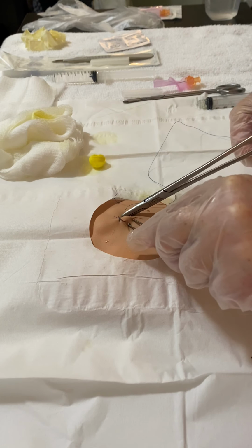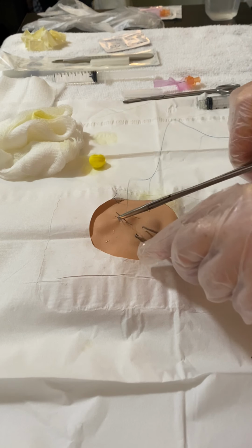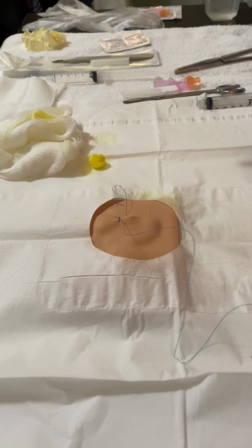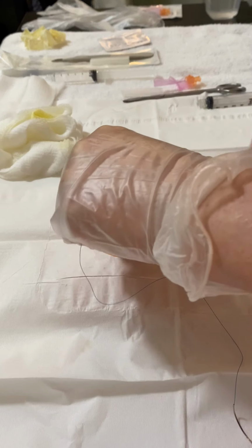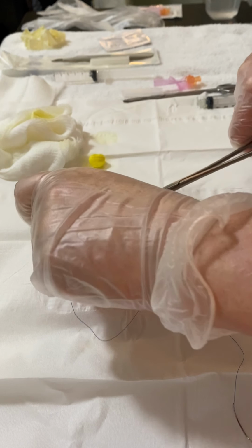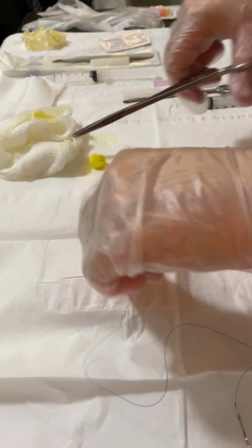2 bites through the tissue. Pulling. Pulling through.